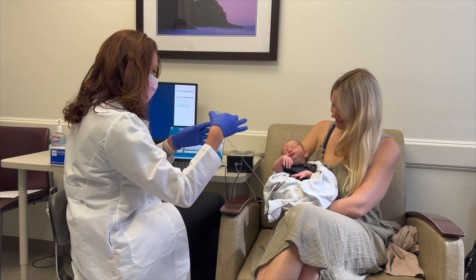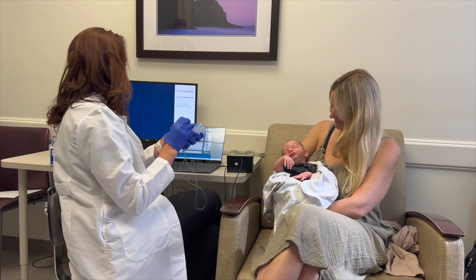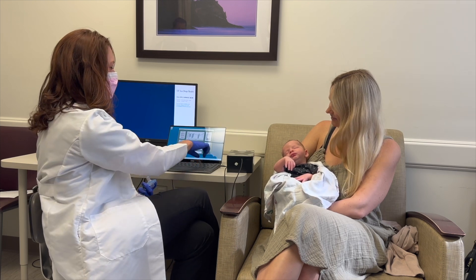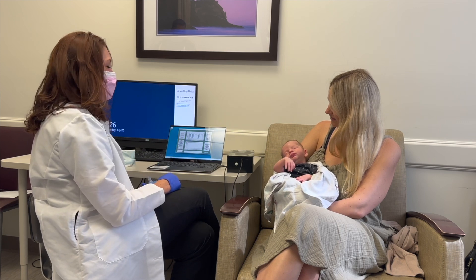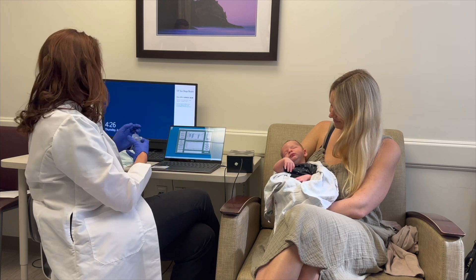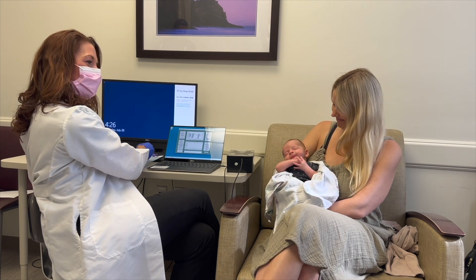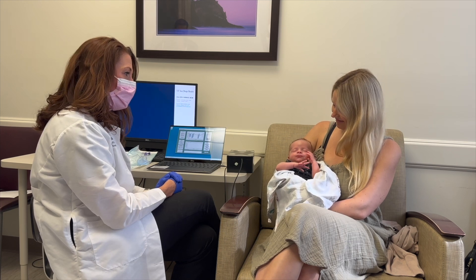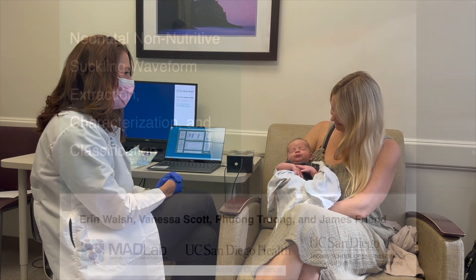This is a pretty good segment for us to analyze, so we'll stop the experiment. These are disposable, so I'll take this. What we have is an immediate readout of his amplitude, how often he was sucking, and this will go into some software that shows us how this compares against other newborns like Henry. It can help us associate any feeding issues they're having and gives us numbers to help make clinical decisions on how to make breastfeeding work.